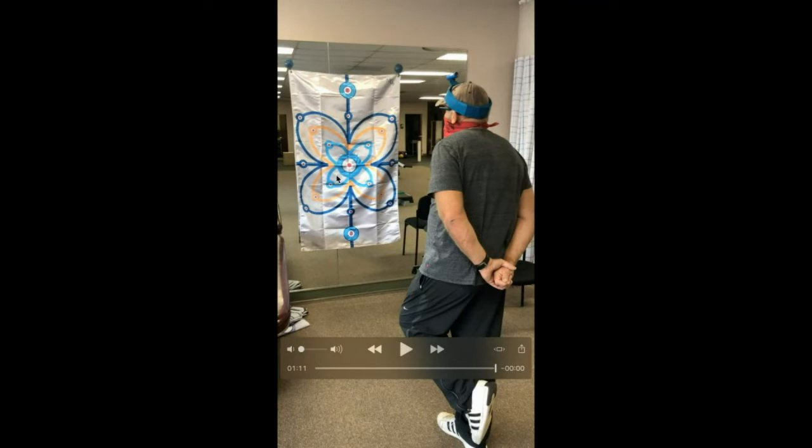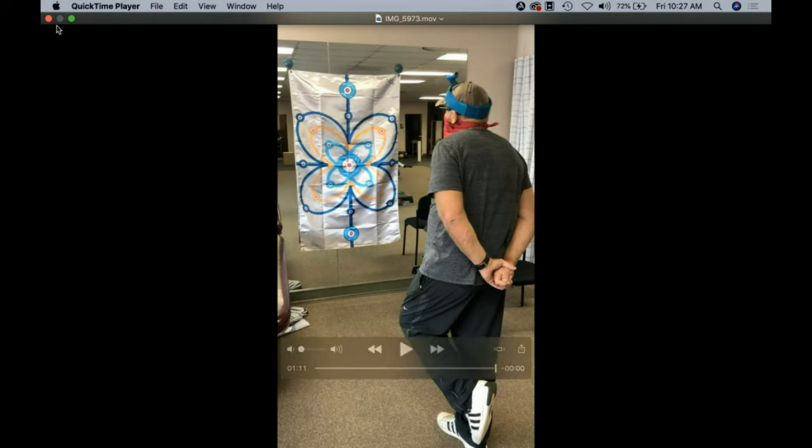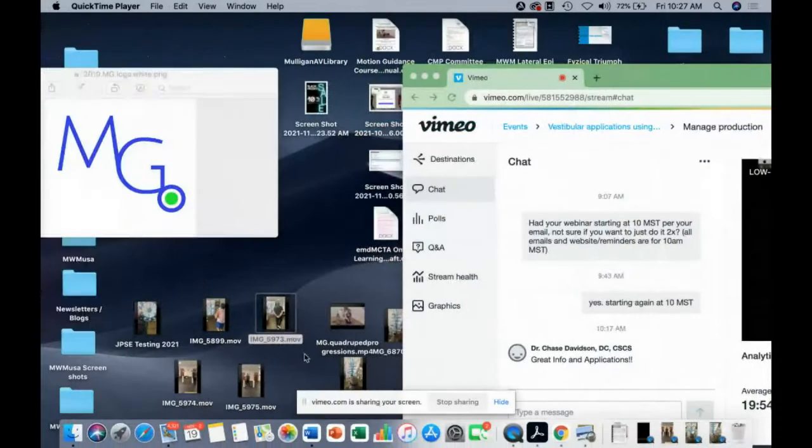We got some things that we got to work on in this position down here to retrain. So I'll probably take him through different size excursions. I'll have him go through different extremes of right rotation to really drive home that right cerebellar activity with the cervical spine, and have him go through those control patterns over in this lower quadrant, based on what we saw with just the simple visual feedback assessment there for us.